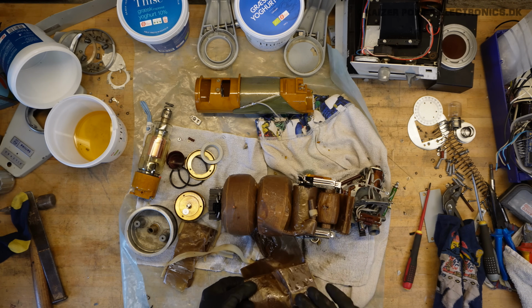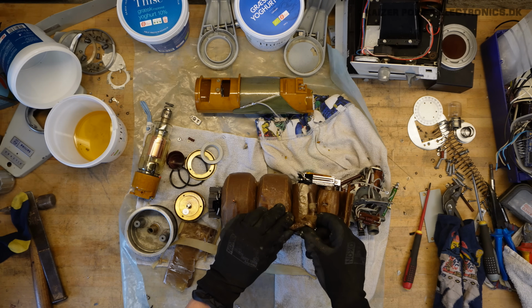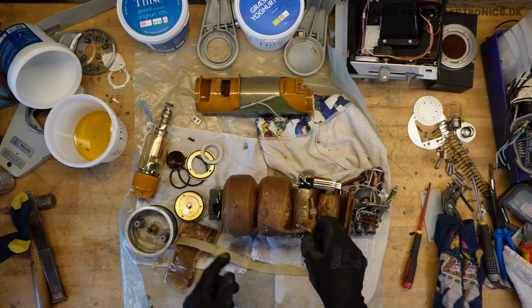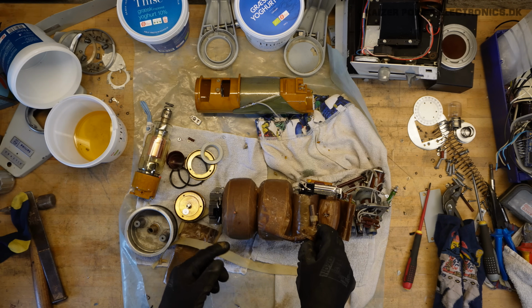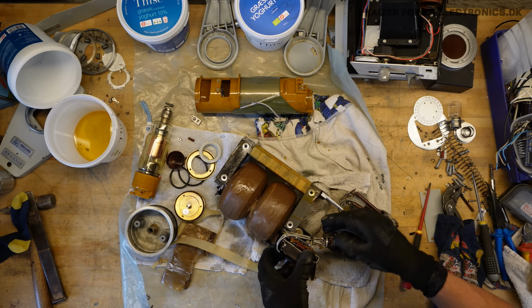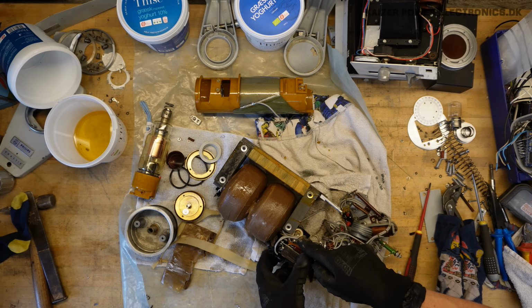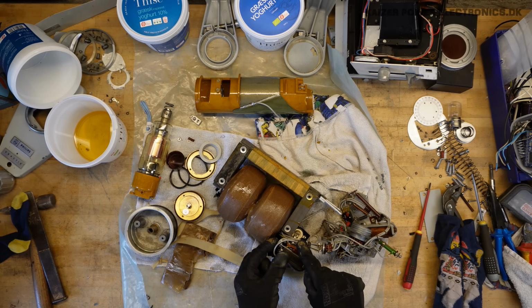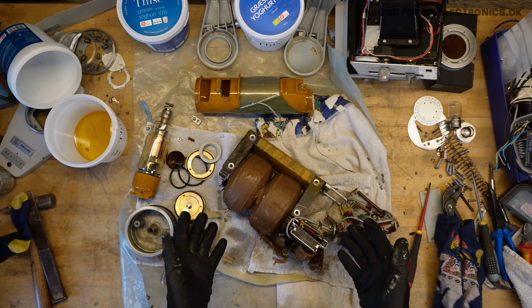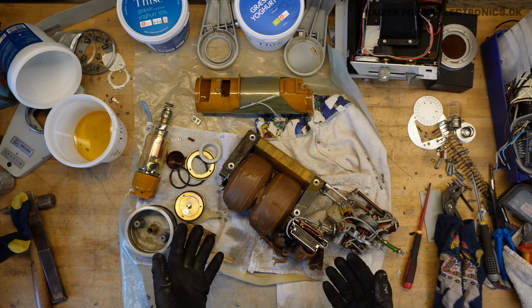Wow, look at that baby. So we would expect this to be midpoint grounded. As we can see, it also has 2 windings. Over here we have some of the gray wires, and we see most of the gray wires actually going into the primary of the transformer here. So from here on, it's quite a bit of cleaning and not getting oil everywhere.